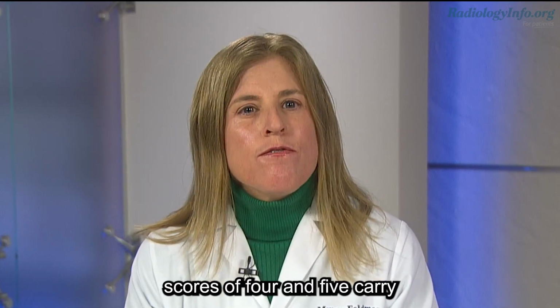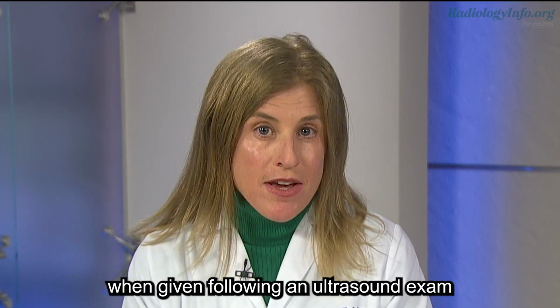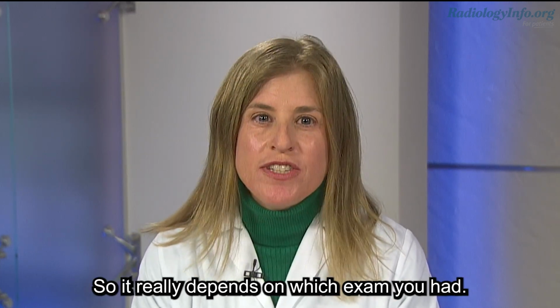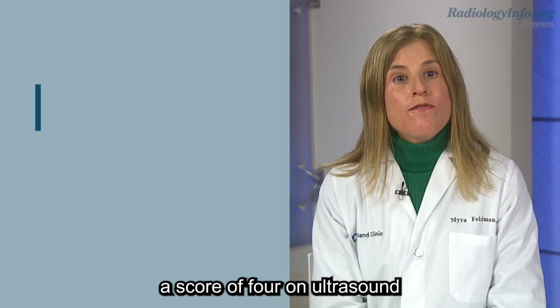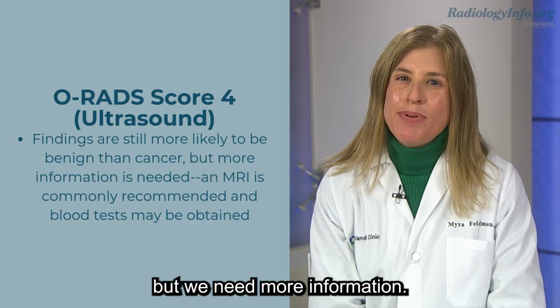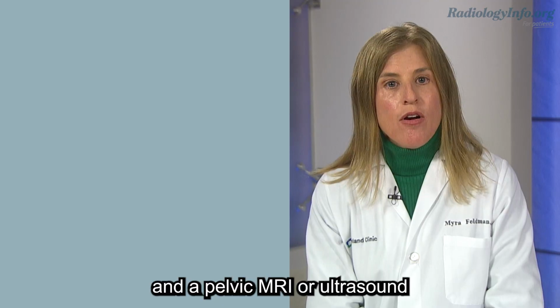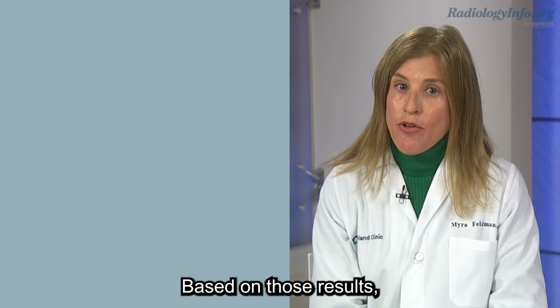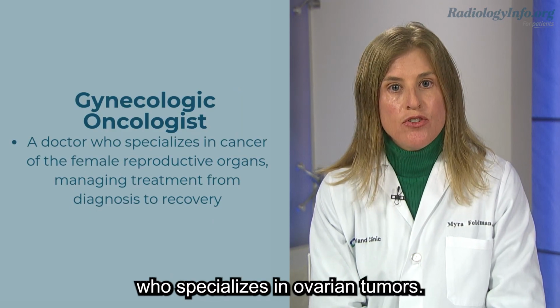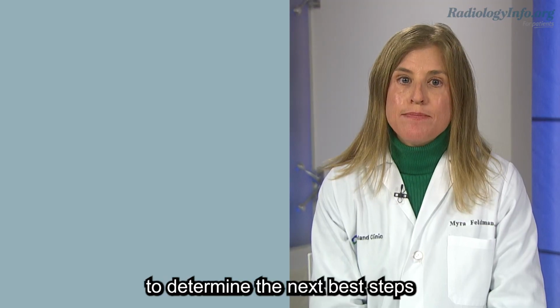Now, O-RADS scores of 4 and 5 carry a different level of concern for cancer when given following an ultrasound exam versus following an MRI exam. So it really depends on which exam you had. For example, a score of 4 on ultrasound means what we are seeing is still more likely to be benign than cancer, but we need more information. In most cases, a referral to a gynecologist and a pelvic MRI or ultrasound specialist will be recommended. Based on those results, your doctor may refer you to a gynecologic oncologist who specializes in ovarian tumors. Together, they will gather more information, which may include blood tests to determine the next best steps that are right for you.